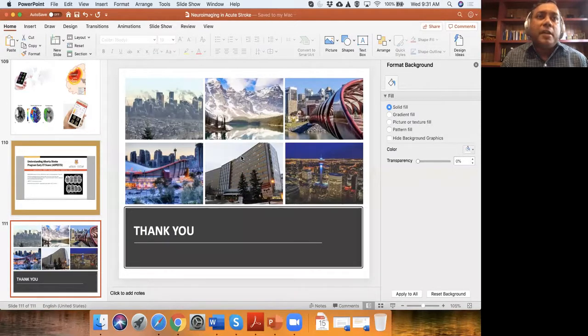The only exclusion is when we clearly know this is a patient with renal failure history and who's potentially not on dialysis. And this patient has maybe minor stroke-like symptoms and not major stroke. It is only in those conditions that we would actually avoid doing CT angiograms. In other conditions, we'll just do it. And we have been doing it for the last 15 years. We have had no issues at all.